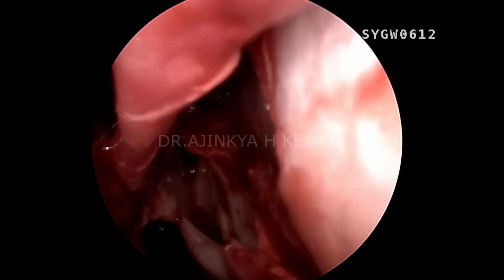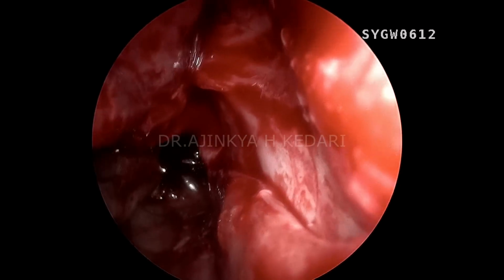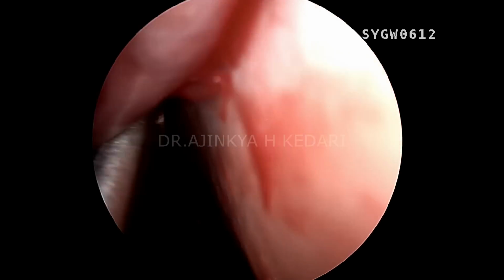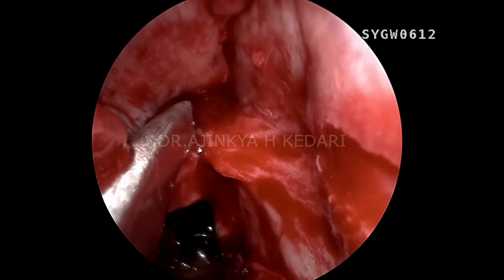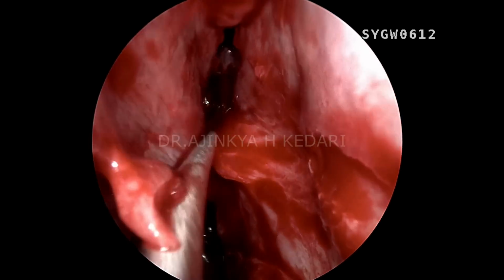So I have not included the nasal floor here in the Hadad flap because I did not want my Hadad flap to be that big. So you can see that's my inferior incision complete. And now it's the time to rotate my Hadad flap and lay it on to my primary and secondary CSF site.